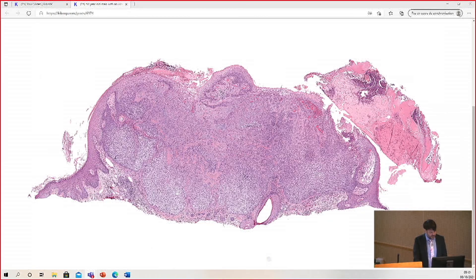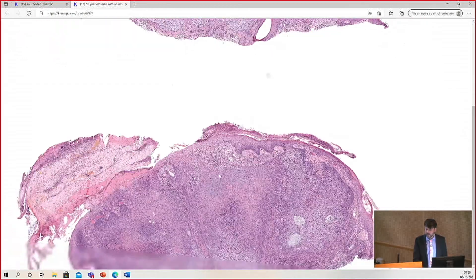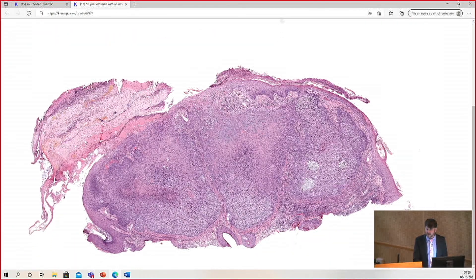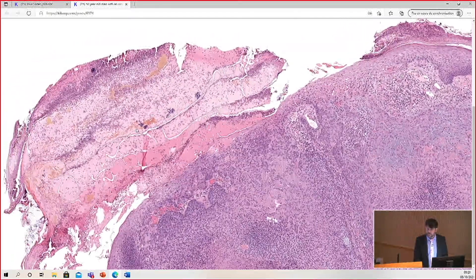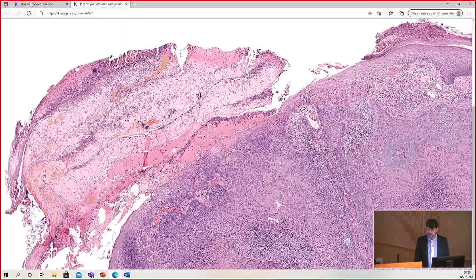This is case number one: a 50-year-old man with an ulcerated papule on the nasal ala. We have two pieces of tissue here. You can see it's a papule. There's the ulcer with a scale crust, bacterial colonies — very common for ulcerated skin lesions.